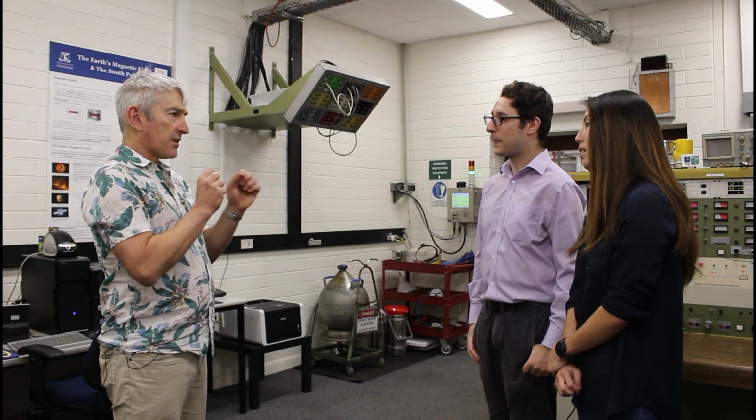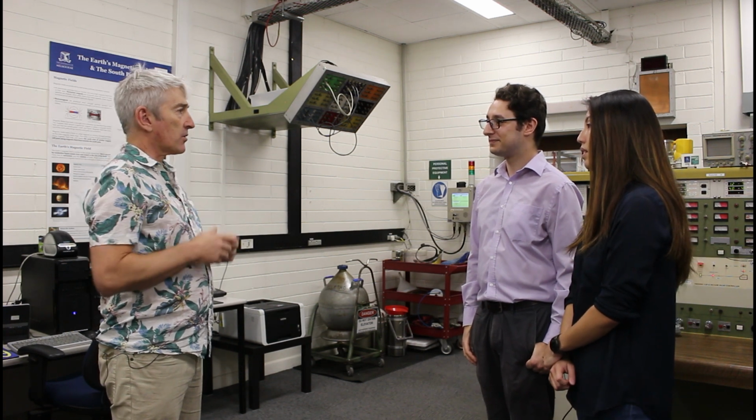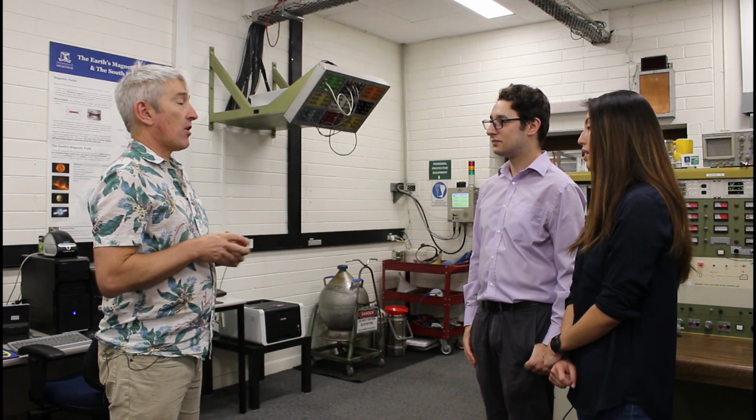So from a physics point of view, what is it that enables the proton to be different to a photon of high energy electromagnetic radiation, light, X-ray? Yeah, it's the way protons interact with matter. We have this phenomenon called the Bragg peak. As protons traverse through, they collide with lots of different particles. There are lots of excitation and ionization events. As they keep going, they slow down. As their velocity decreases, the likelihood of ionization events increases. So they slow down, come to a point where they just about stop, and they deposit most of their energy at this point called the Bragg peak.